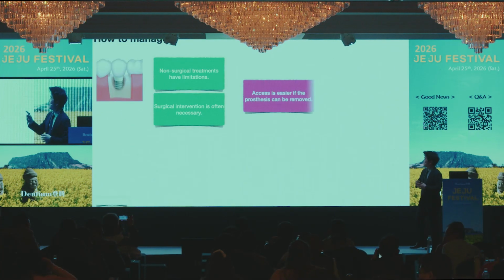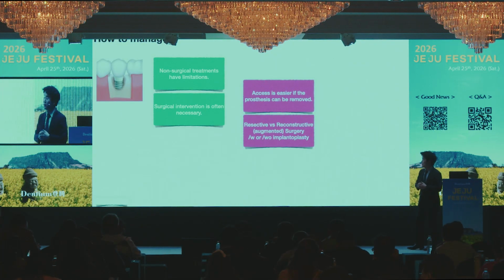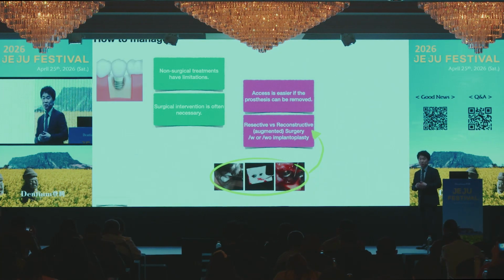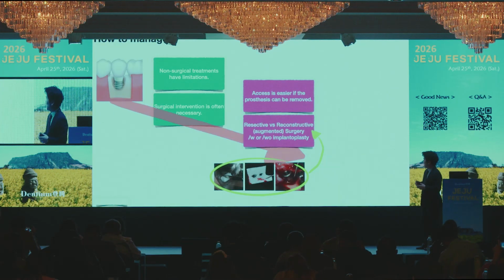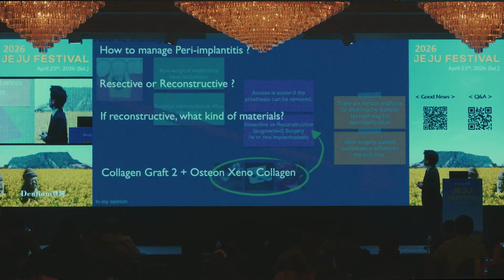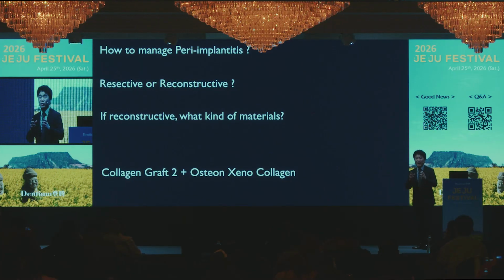Finally, non-surgical treatment has limitations. So surgical intervention is often necessary. Access is easier if the prosthesis can be removed. Resective versus reconstructive surgery, with or without implantoplasty. Finally, there are various methods for cleaning the surface. So SPT is very important.